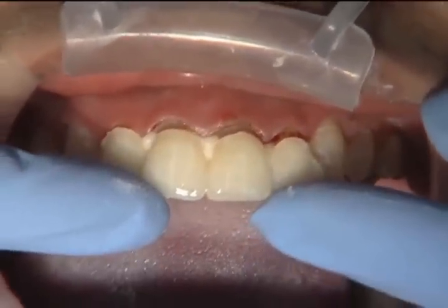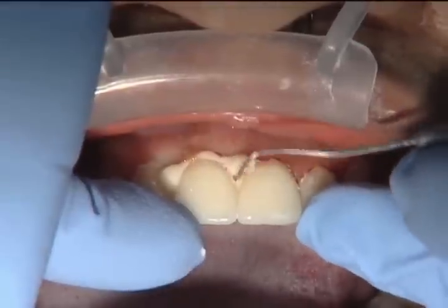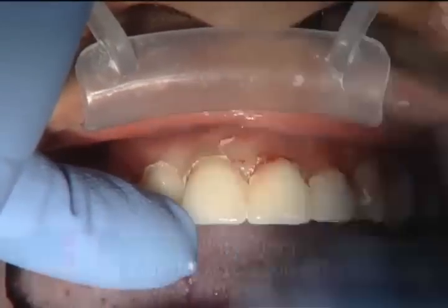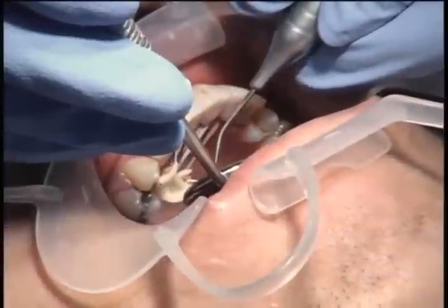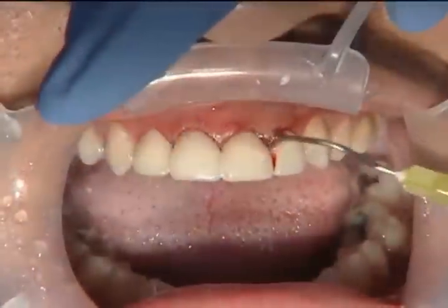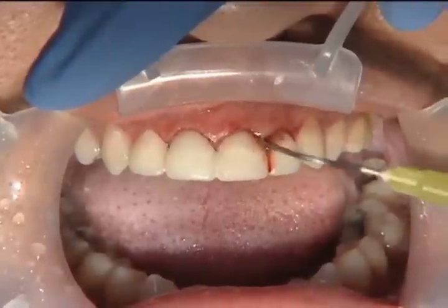We're going to reline the BioTemps. You can do this with Bisacryl or acrylic — we're using acrylic, which is preferable because we can manipulate the BioTemps during the doughy stage. With Bisacryl like Luxitemp, it's easier, faster, less heat, and doesn't smell as bad, but you always risk locking the BioTemps onto the preparation. We really try to use acrylic whenever we can — it's more of a hassle, but it lets you pump the BioTemps up and down without locking them into place.